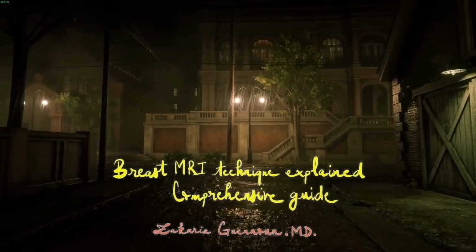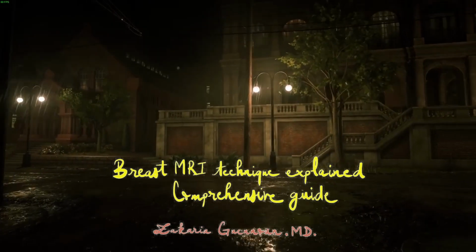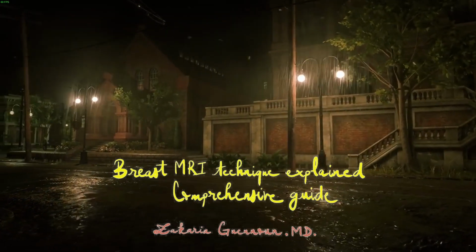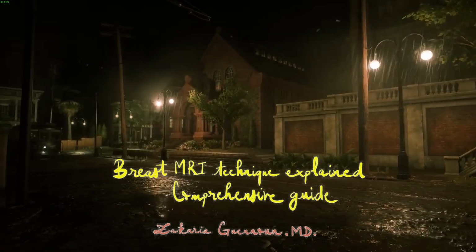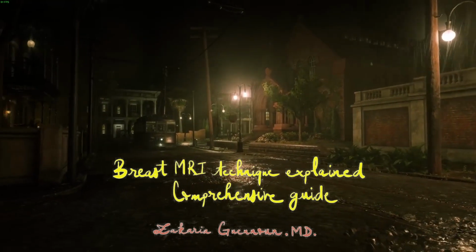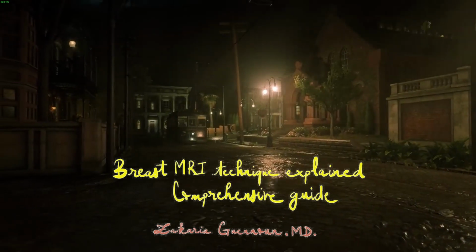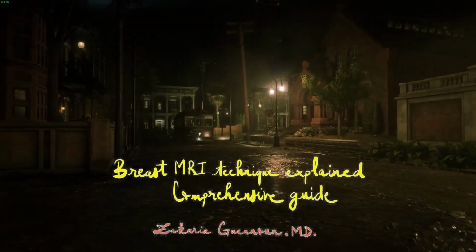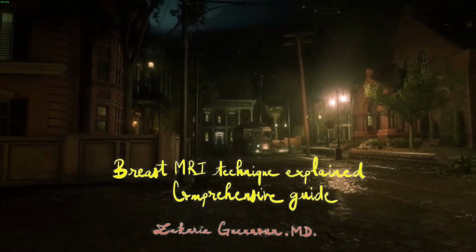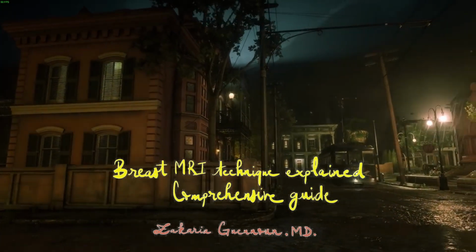And on the other hand, if you do images with very thin slices, you will not have time to do multiple post-contrast scans, and you will lose some temporal resolution. In the end, there will be some compromise between spatial and temporal resolution. And in my opinion, spatial resolution should be prioritized over temporal resolution, because the main factor for interpretation of a lesion on breast MRI will be morphology before kinetics.